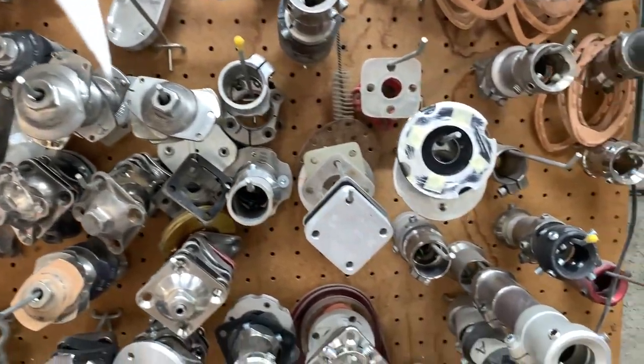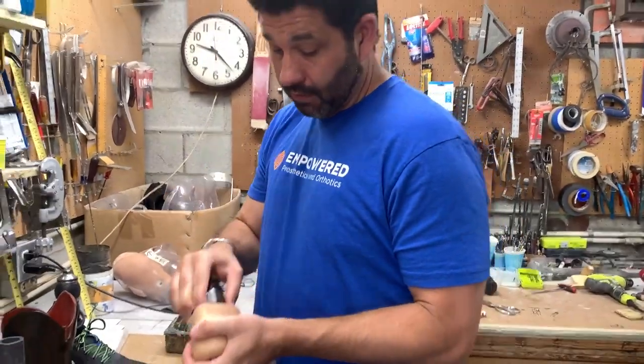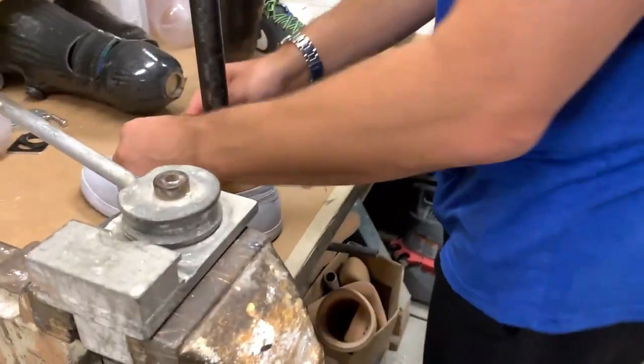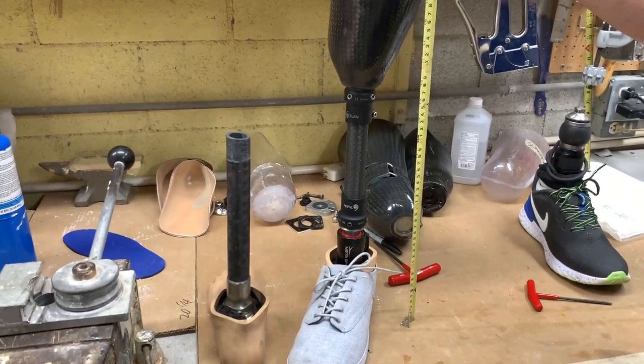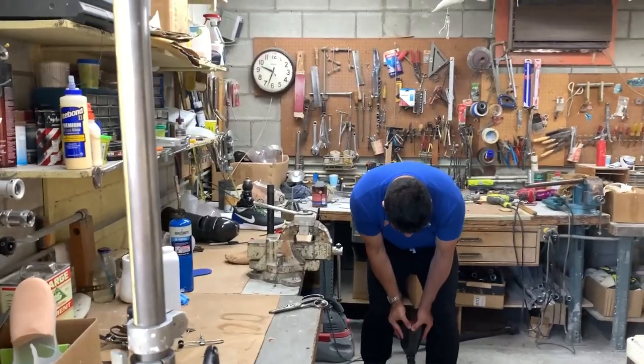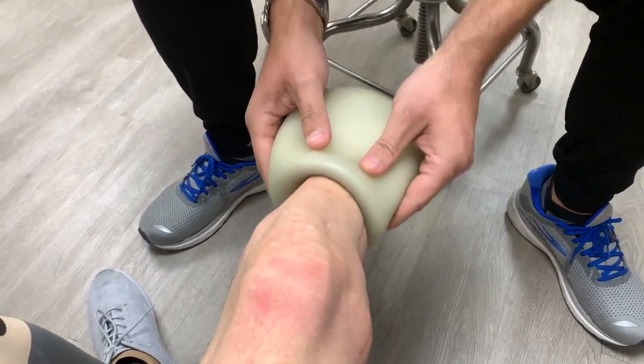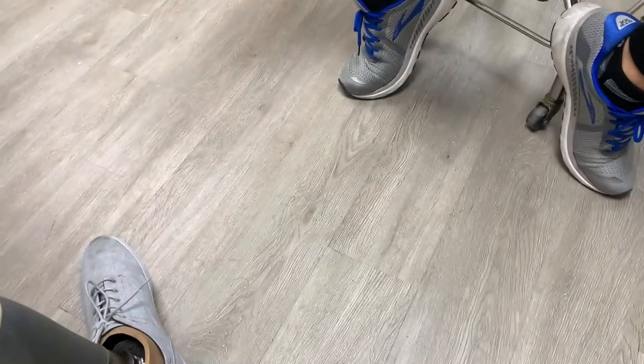Ryan Russell is the man — definitely come check him out. We're gonna try out the new foot and get it fitted, see how it goes. Normally you gotta wrestle with it, so the prosthetic is friendly. Drop it down about a quarter of an inch. The liner's great — you're notorious for being hard on yours.